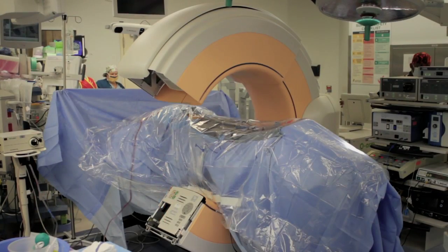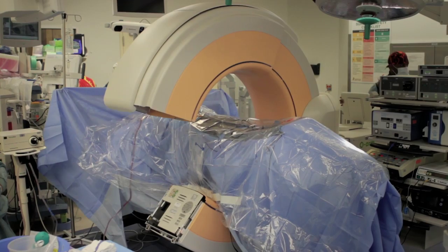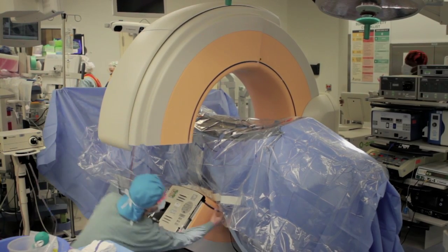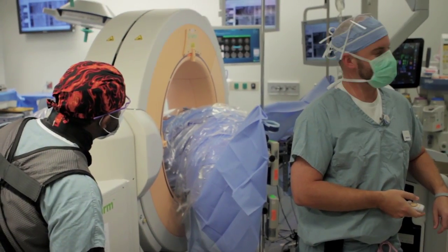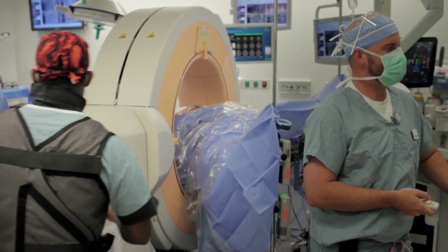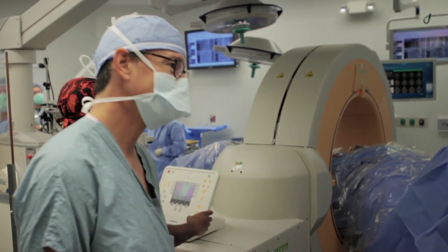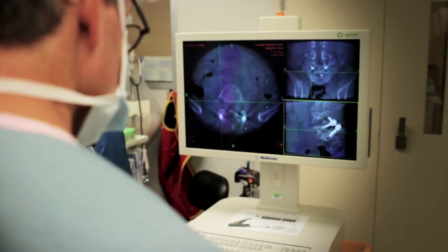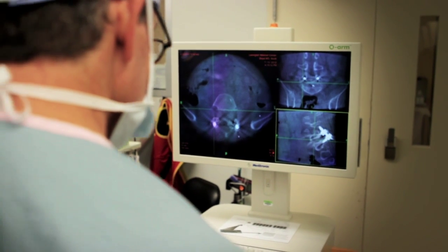With the O-arm, the patient comes into the operating room. When the O-arm acquires a three dimensional image of their spine, I can pinpoint where a disc herniation is or where a nerve root might be that's entrapped.